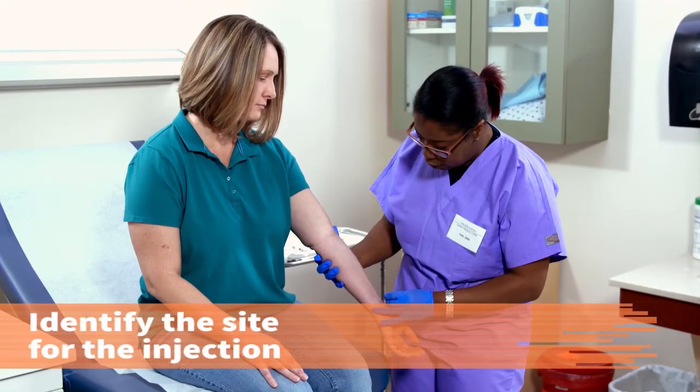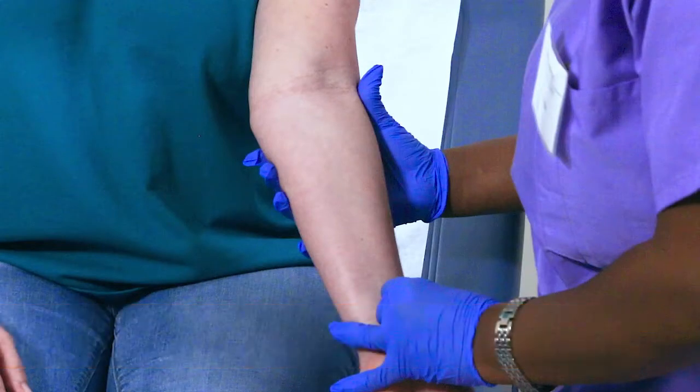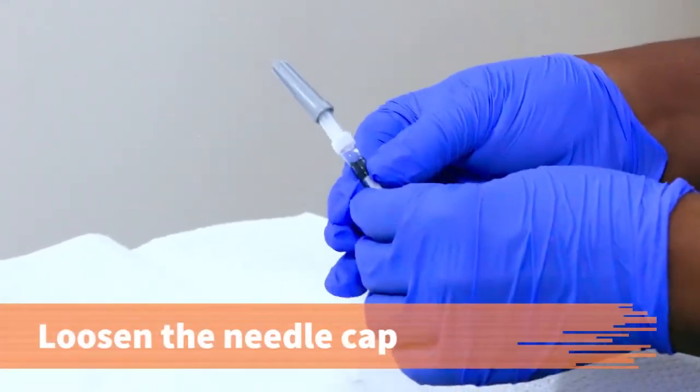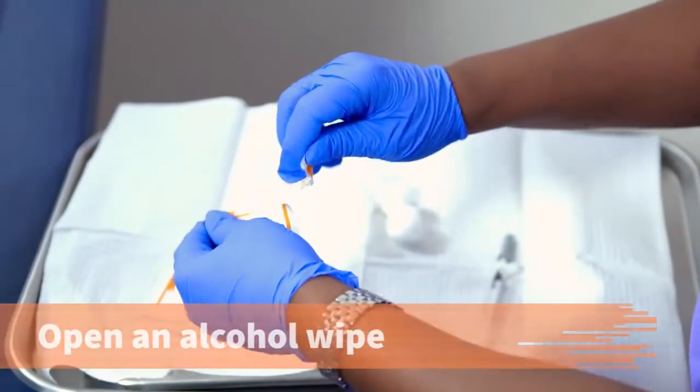Identify an appropriate site for an injection. The site should be 2 to 4 inches below the elbow, free from veins, scars, or wounds. Loosen the cap on the needle so that you'll be able to open it with one hand once you clean the injection site. Open the alcohol wipe.